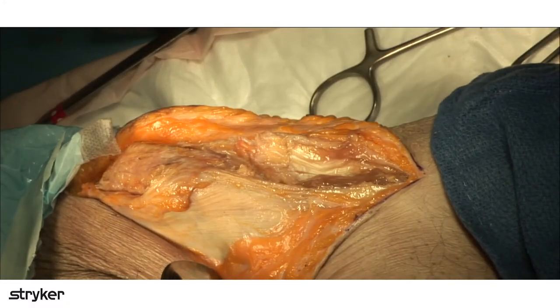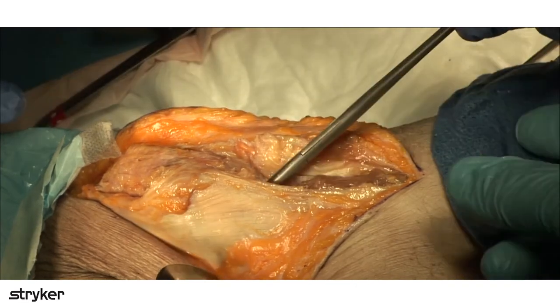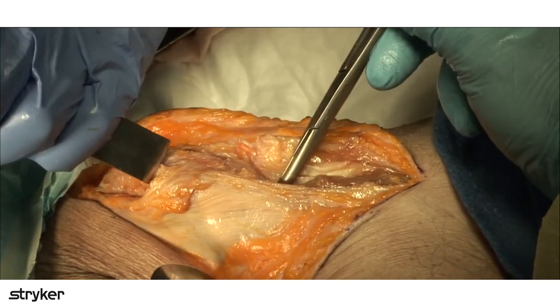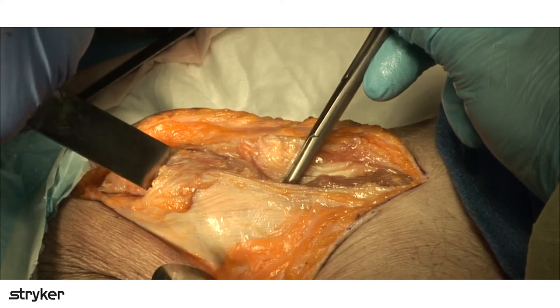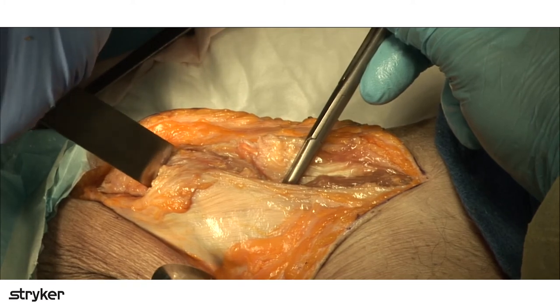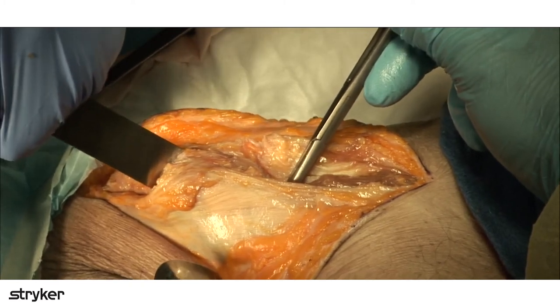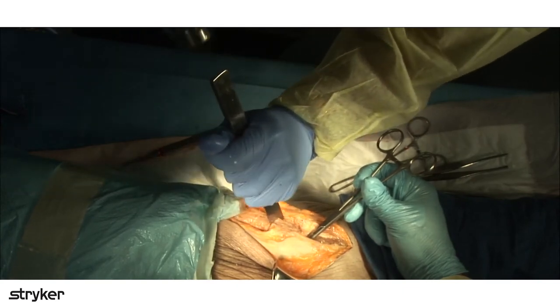So you define where that interspinous notch is, pass something through there, and then aim your osteotomy at it. I tend to do it almost as an L-shaped or right angle osteotomy so that you have a nice corner to reduce at the end, but you don't have to.